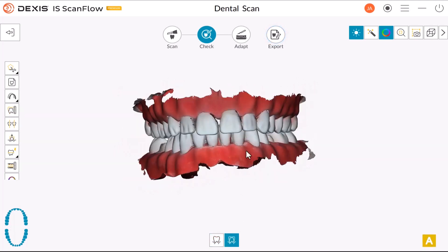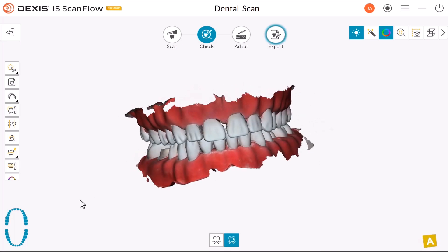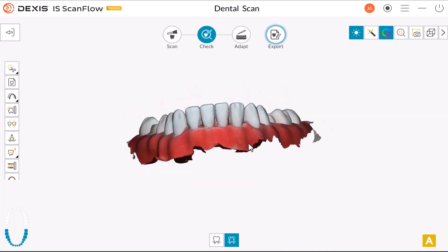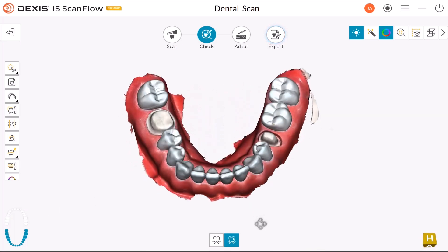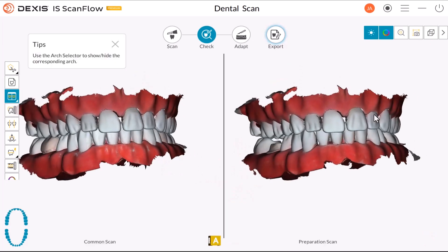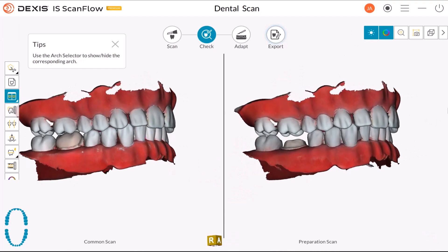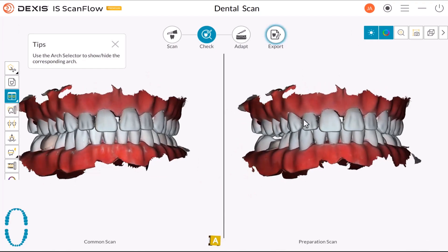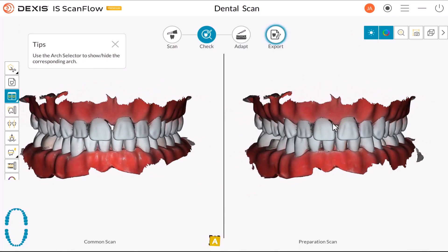Click here to display the Preparation Scan mesh by itself. Drag the toolbar to move the image. Click here to display the model in the Dual View mode. You can manipulate both images in the split-screen view at the same time using the following methods.